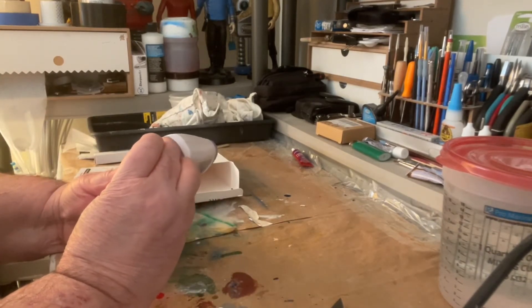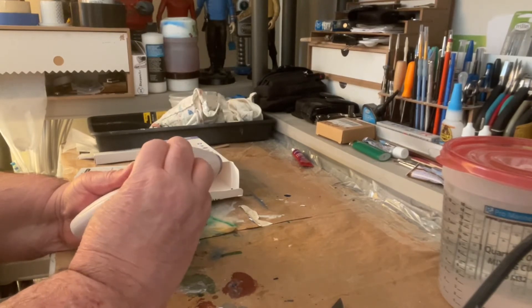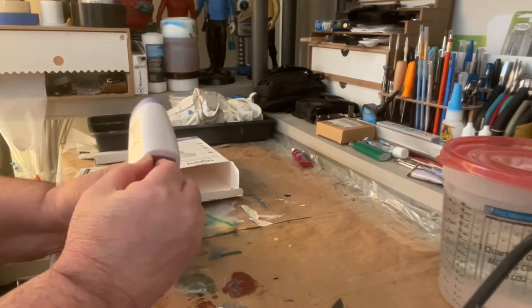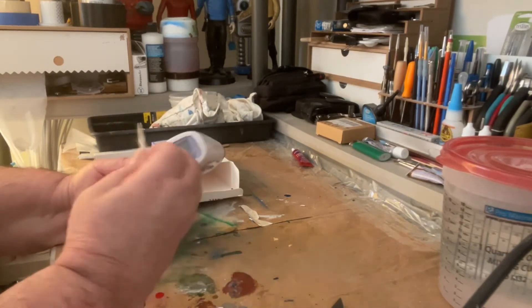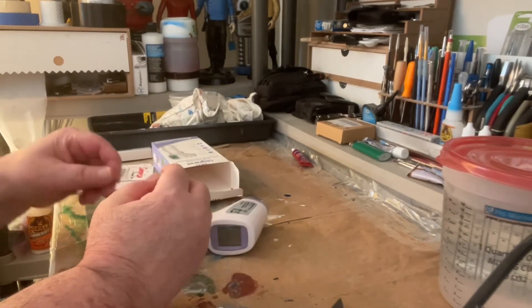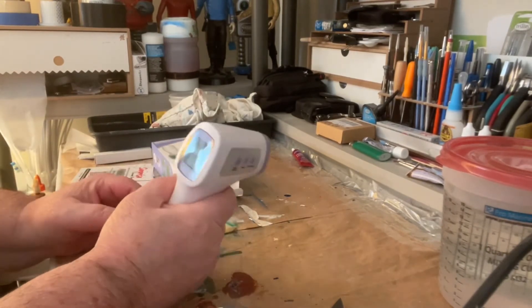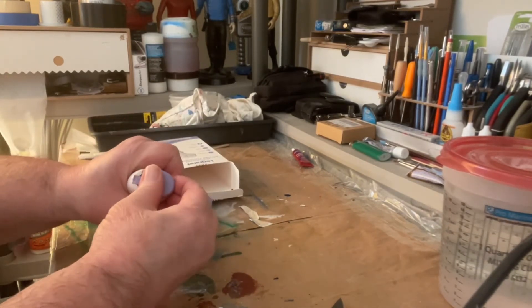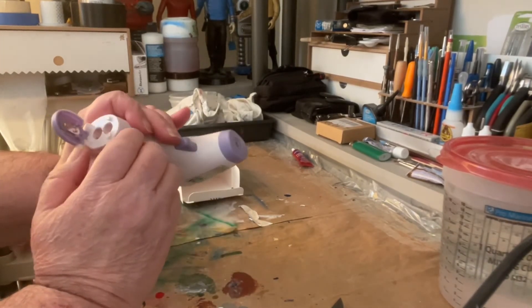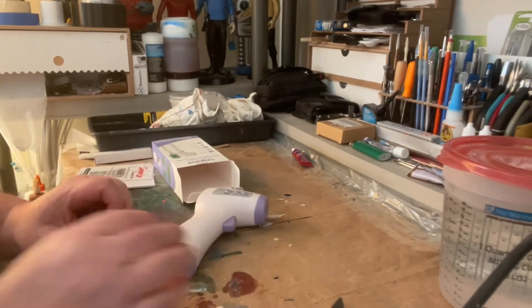Let's peel this piece off here — there's a little film right here. Good thing I didn't cut my nails today. I don't think it has batteries, so I've got to push this down. It looks like it takes four AAA batteries, so I'll be back.